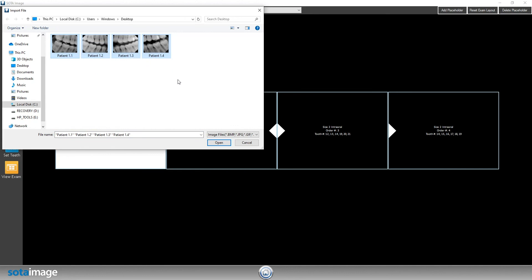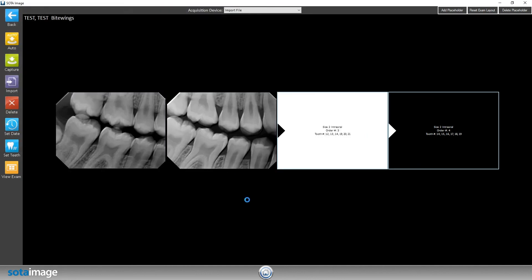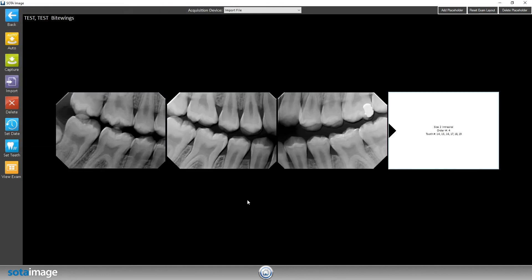I'm going to highlight all four of those exams by dragging on top of them, then click on open. That's how you import exams.